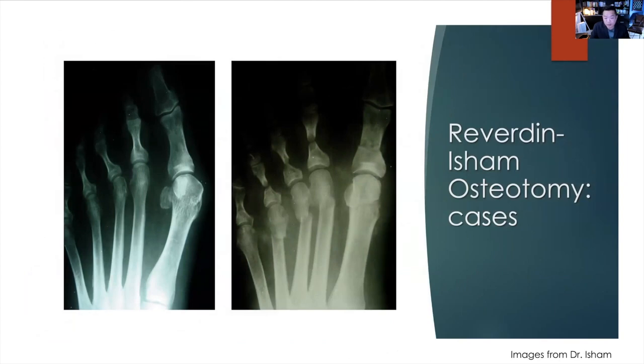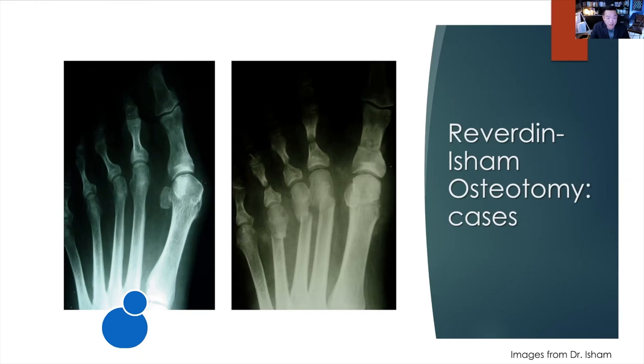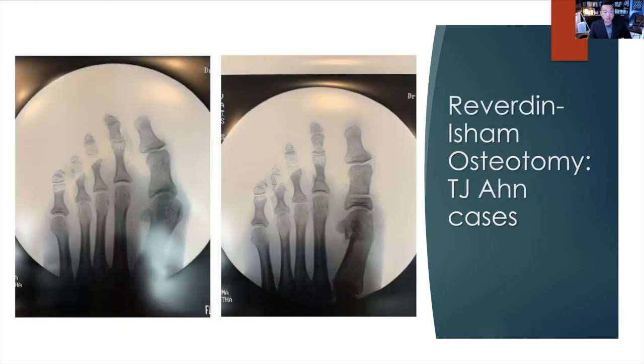Some X-ray case studies before and after. Again, this is a shortened version. If you come to our cadaver lab conference, Dr. Isham usually has a full lecture on Reverdin-Isham osteotomy. So here is Reverdin-Isham, lesser metatarsal osteotomy of 2-3-4, and also the Isham hammer toe correction right there. This seems to be right after surgery, and this image is from Dr. Isham.